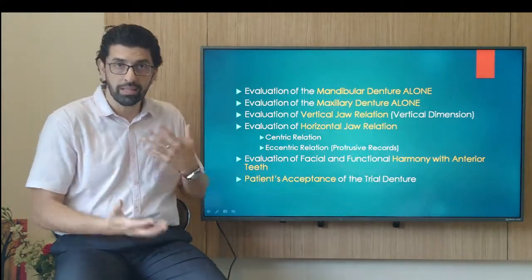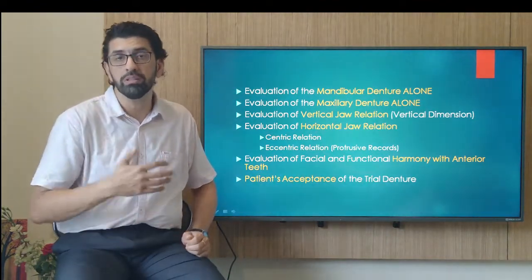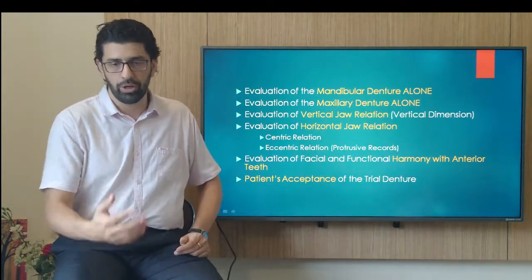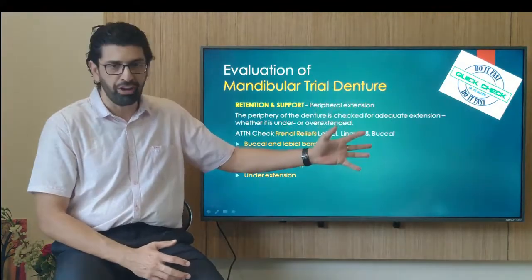Okay, so what's the aesthetic aspect of it? Is it functionally good? And finally, we are going to look at how the patient feels, and what are the considerations with regard to the patient's acceptance of this arrangement. Okay, so this is a quick step, right? I put up there, do it fast, quick check, do it fast, all right?